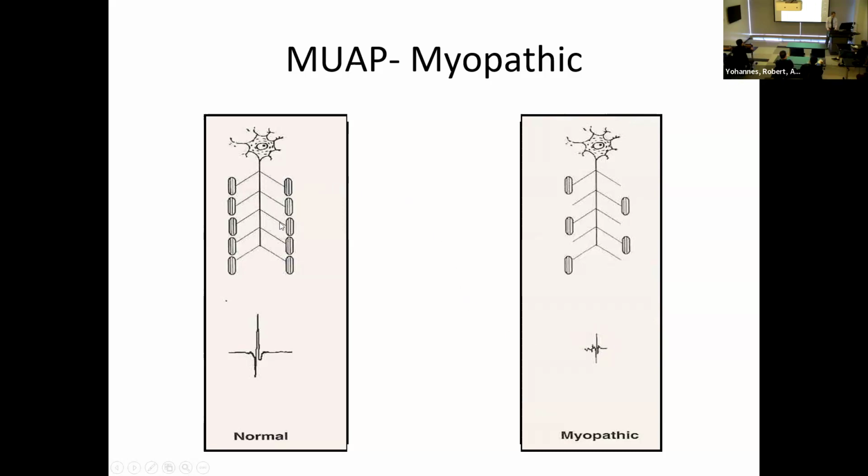Because it doesn't have this very organized structure of all the muscle fibers around the needle with the waveform first kind of growing up and then maximum and then goes away. It's pretty random where we lose the muscle fibers in each unit. They could be all very far away from the needle, some close, some far away. Usually it's random, right? And that's why we see this kind of erratic shape. But the important thing is that it's small, okay? So we look for small polyphasic units. They may be polyphasic and they're small, okay?